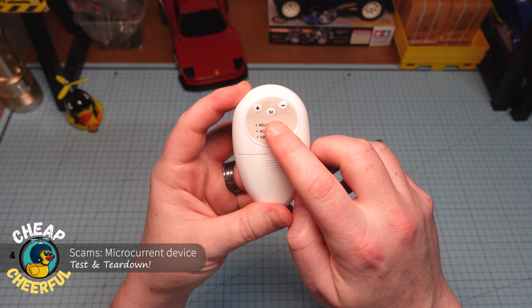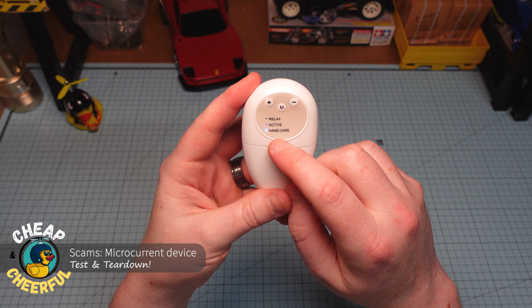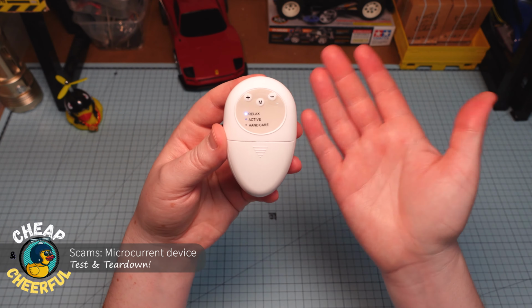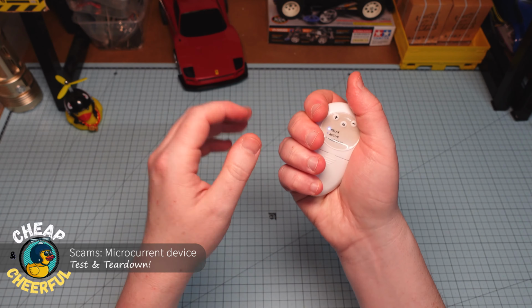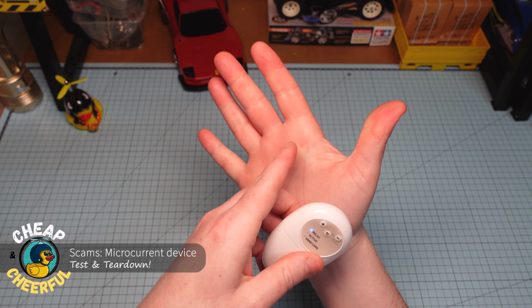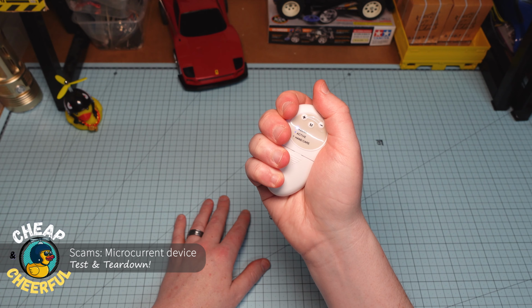We hold down the M button and we get a light. So it's now in hand care mode. Let's put it in relax mode. So it's on level 1 at the moment. And yeah, you're supposed to just grab it in your hand like this. Right now, it feels like a tickling in my palm about here. Okay, now it's feeling a bit more than tickling.